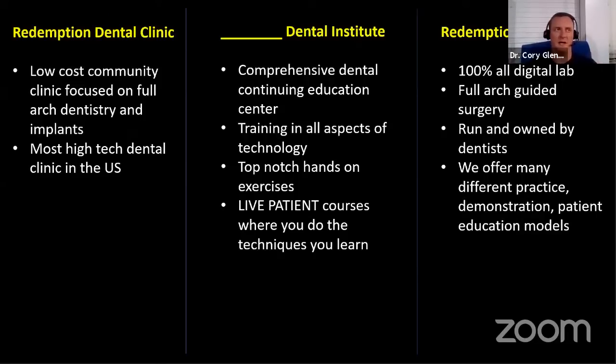Really the only good way to do true full arch hybrids on implants and actually have it be passive right now is using this Medit scanner, because it can correct your implant positions of an intraoral scan down to like 2 microns of error cross arch. It's crazy. We've got a Carestream 9600 cone beam that does the whole head. We've got a facial scanner built into that.